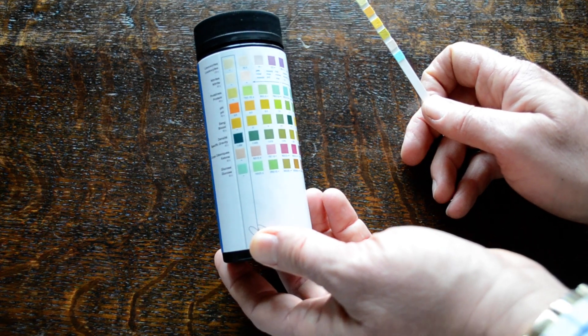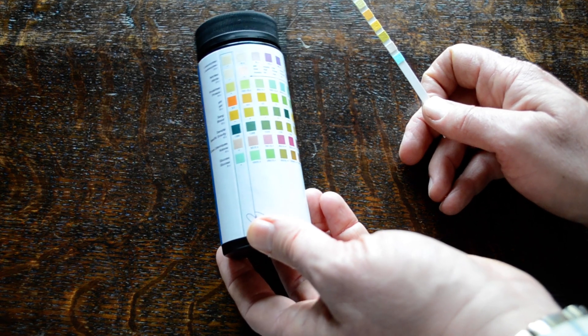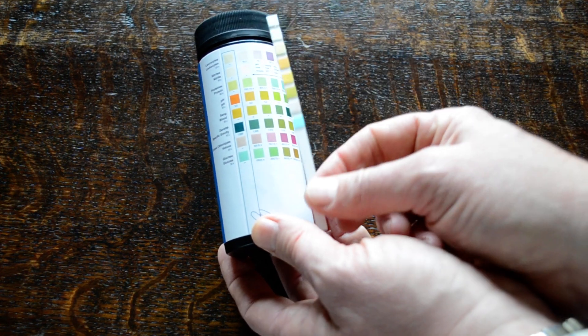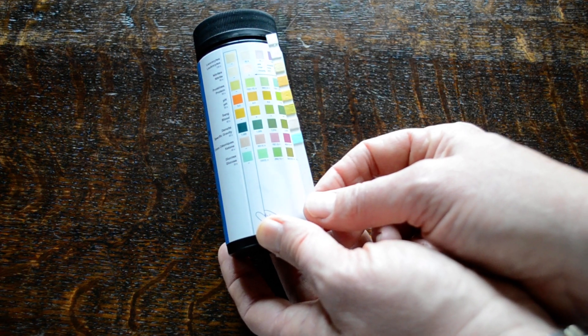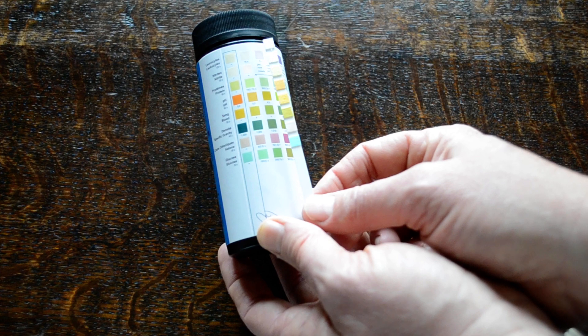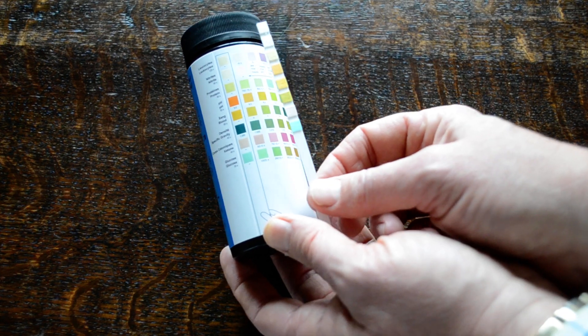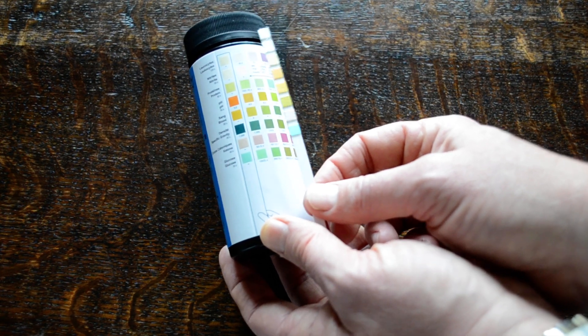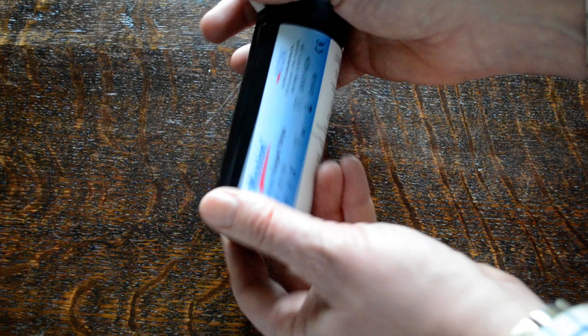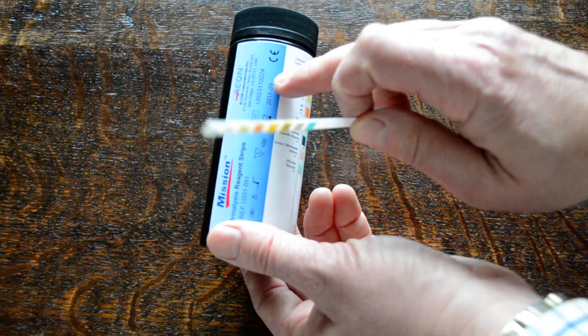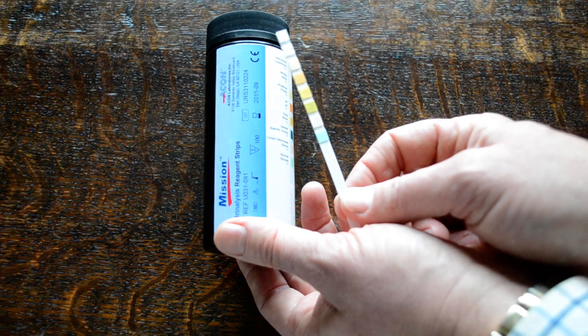As soon as these start getting moist, you can get some deterioration in them, so always put the lid back on. Next thing to check is expiry date on the lot to make sure you're testing within expiry.